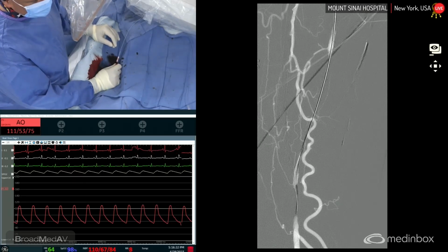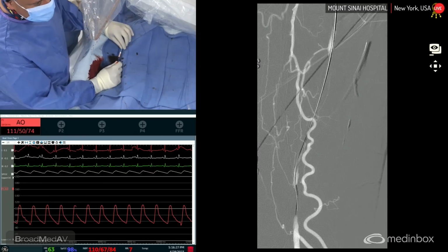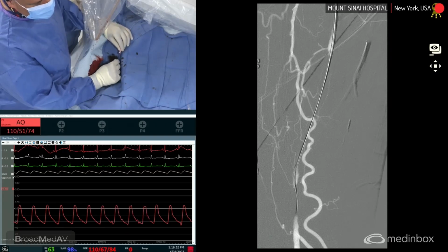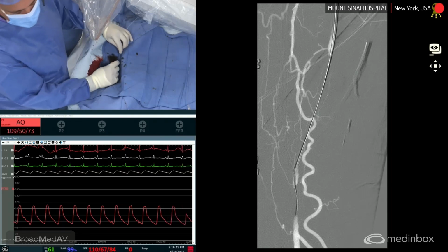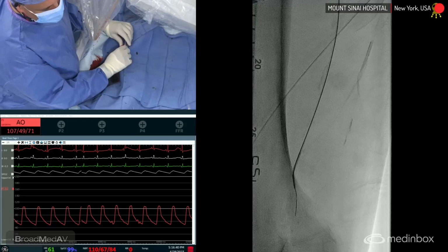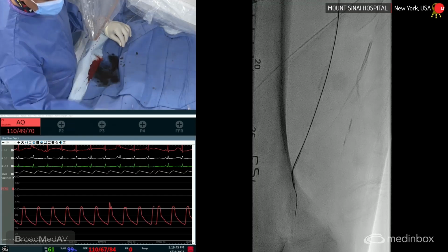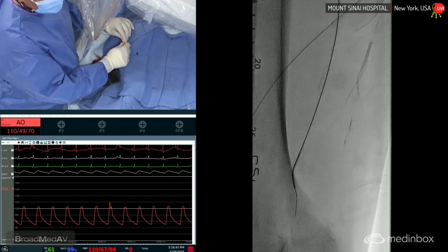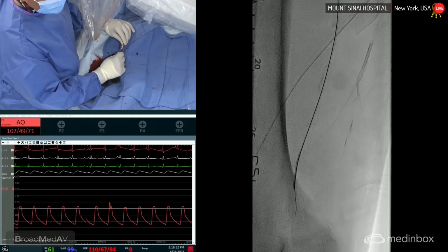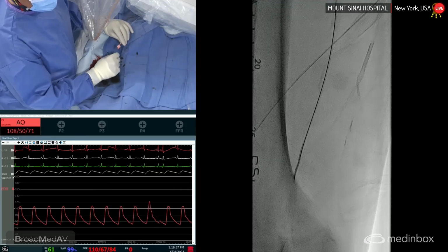The catheter is going down. See where, yep, keep coming. So the catheter comes down a little bit. I can't quite see the catheter here, so okay, come down with the catheter. The short segment, and sometimes they behave weird, obviously. The wire's starting to unravel. So we'll just pull this back.